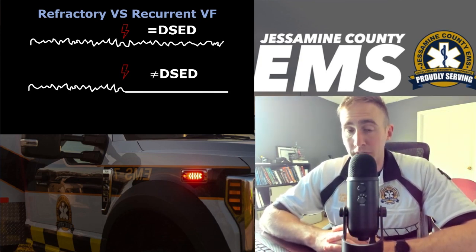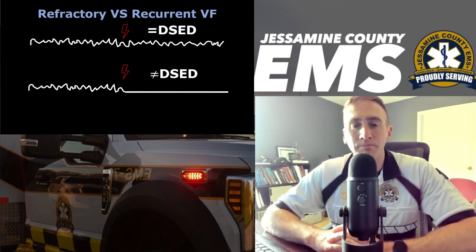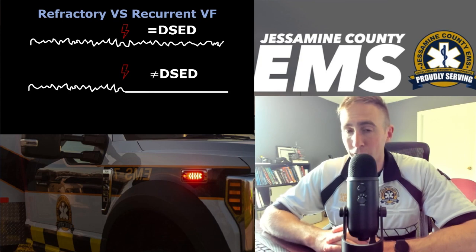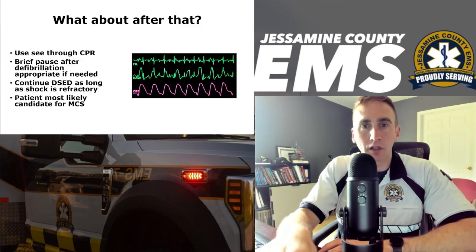If the rhythm did terminate to asystole, PEA, or ROSC, well, if it was ROSC, then of course we're not going to do it. But if the rhythm did terminate, that means that it's not refractory. It might be recurrent. The patient is still likely a candidate for ECMO, but the shock is working. It is technically effective at terminating that rhythm. Therefore, we would not do dual sequential.